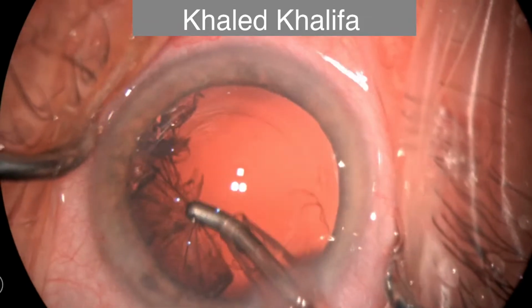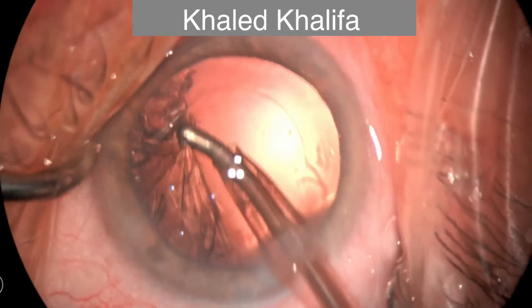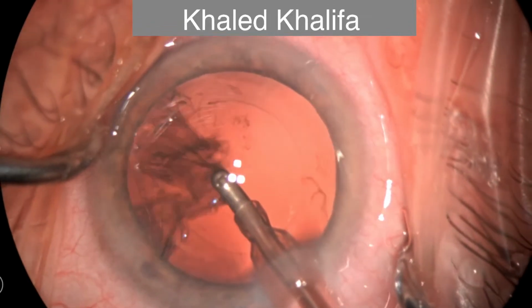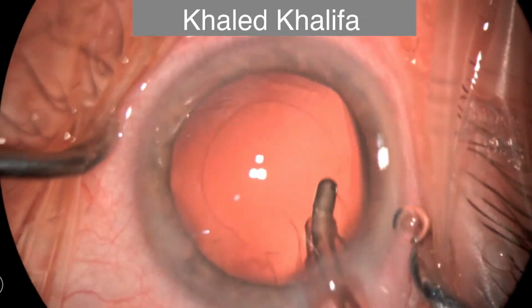Now this is the cortex parameters. I'm using linear vacuum with fixed flow rate, aspirating the cortex in one bulk, then taking the cortex from inside the eye by the IA handpiece.